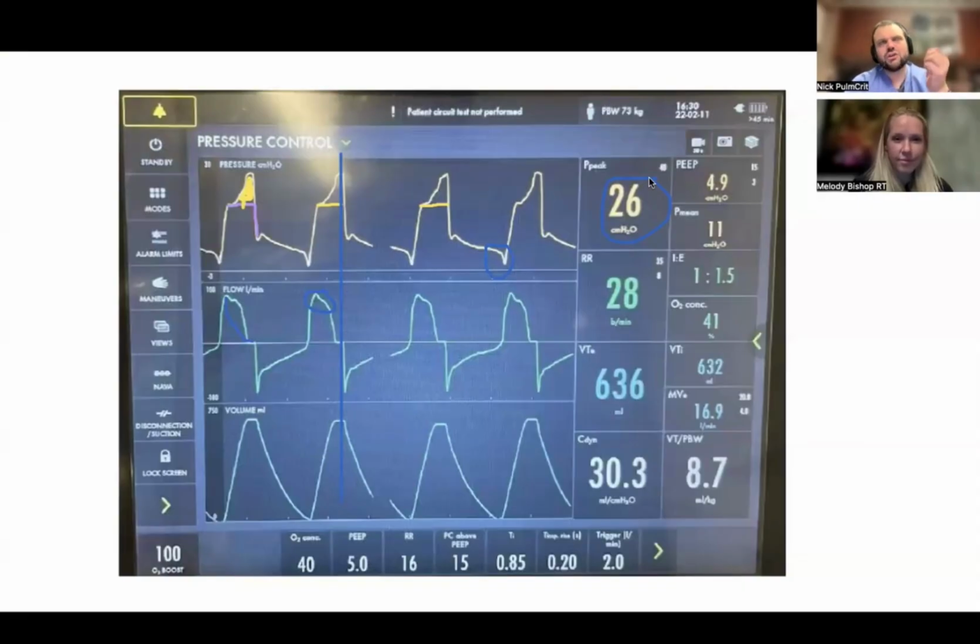So either you're going to set a higher inspiratory pressure support for some time, or you're going to decrease the time. They're going to breathe faster. Now you're going to have to negotiate the auto-PEEP with that. But I think the thing that we're both highlighting is that you're just taking the vent out of the patient's way and letting the patient do what they want, and then sort of backfitting the ventilator settings.